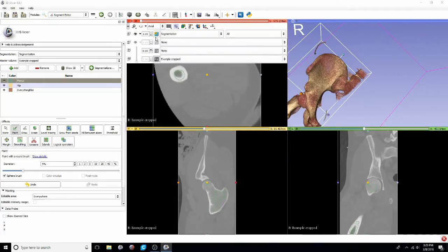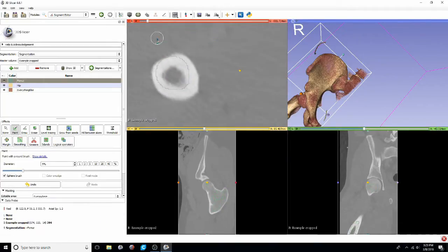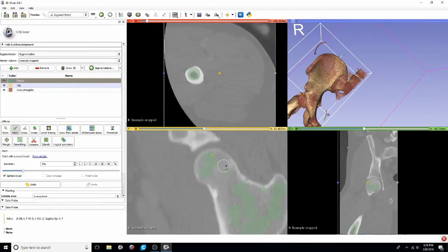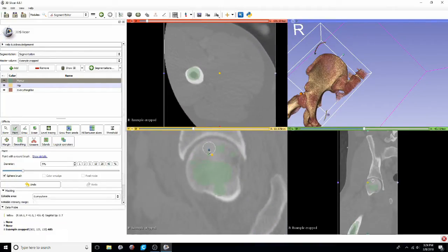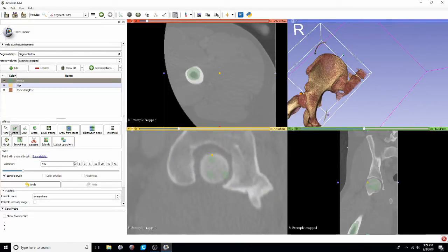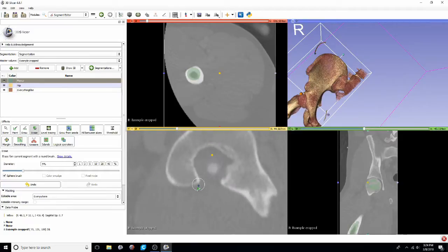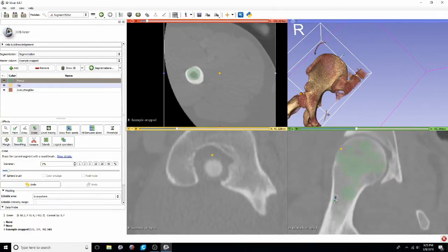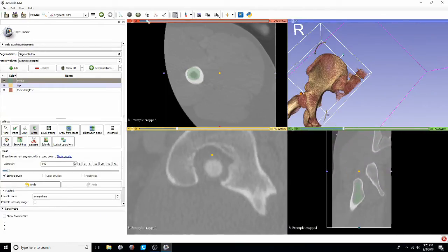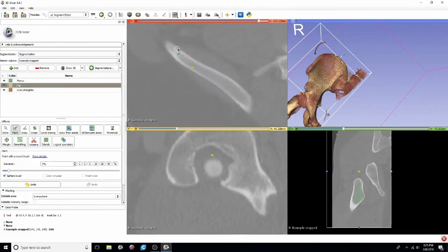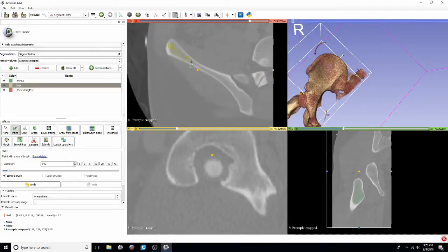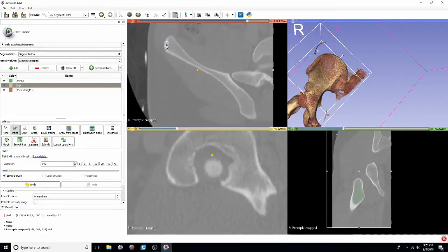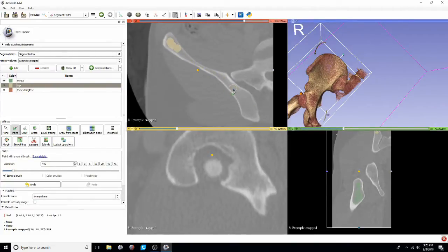You can also always go to the outline view for the label so that you can better visualize what is labeled and what isn't. Make sure if you're using the sphere tool to constantly be scrolling through all of the slices to make sure that you're not labeling other structures. When you're creating these seeds with the paint tool, you'll want to add as many as possible. Obviously, the more that you add, the better the segmentation will ultimately be on the first pass. So investing some time now can really save you time down the road.